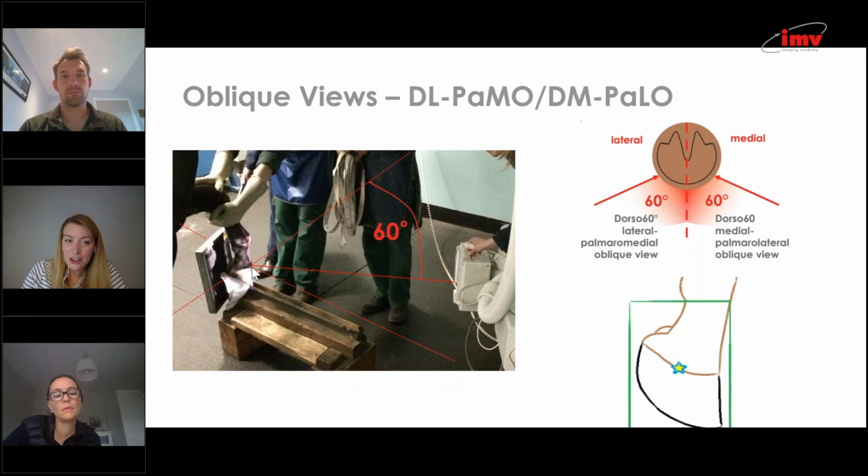So just try to remember that you're centering at the dorsal aspect of the coronary band, which by the time you come round, you'll be centering pretty much on the frog or somewhere on the lower heels, which feels a bit odd, but it's right. But that would probably be a little bit easier in a weight-bearing limb because it's level. So I hope that makes sense.